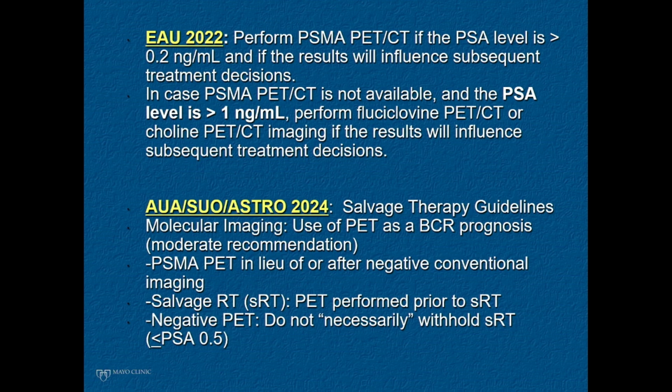So we have some time here. Certainly a negative PET, though, should not necessarily withhold salvage radiation therapy, because there is some data that if we're going to do early salvage, we need to institute salvage therapy prior to a PSA or at a PSA of 0.5.